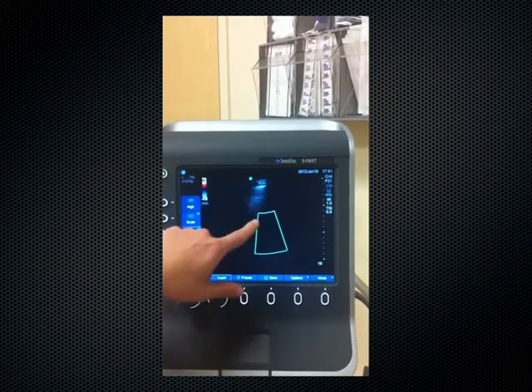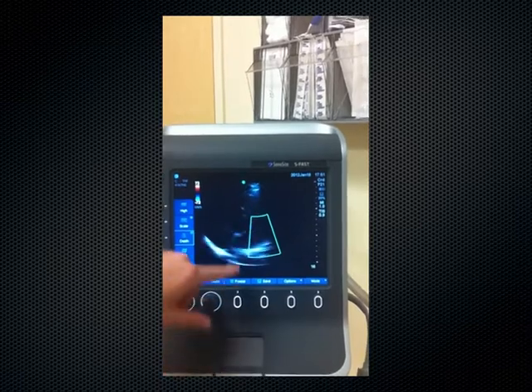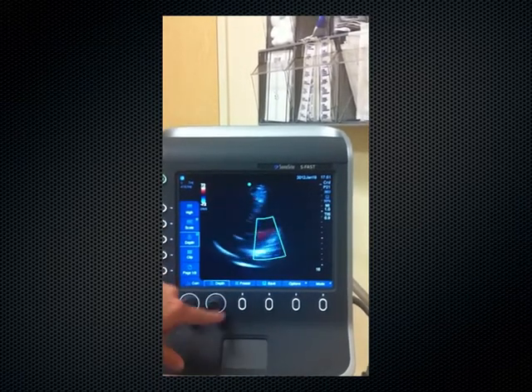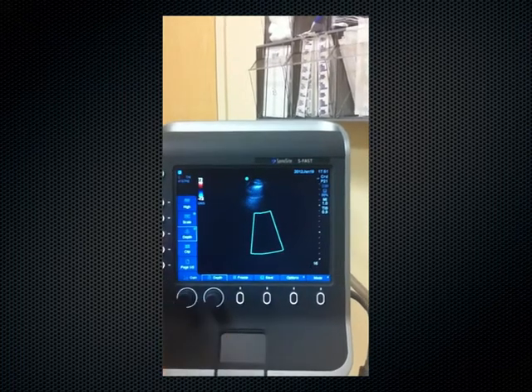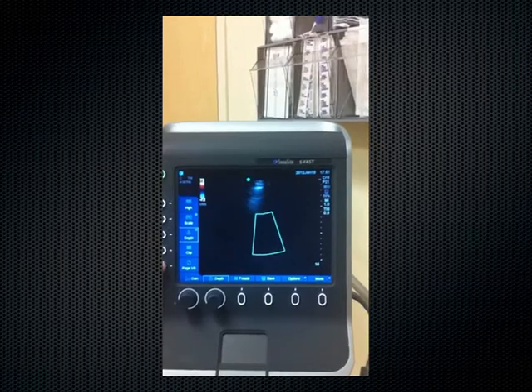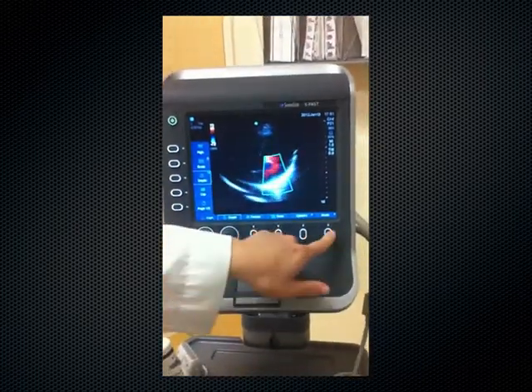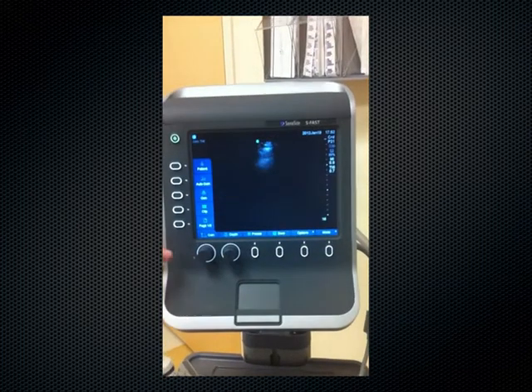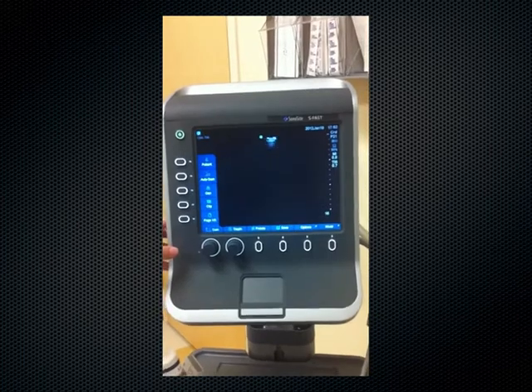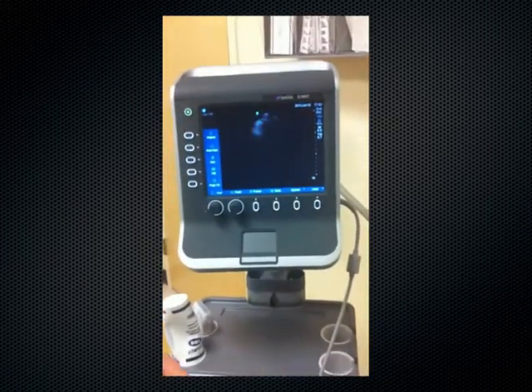What you see also here is the aortic outflow tract, and that's actually a 5-chamber view right here. The next thing I need to do is go back to calculations. So I would go mode 2D. Mode 2D. Can I get that off there? And get a nice 5th chamber. Let's see. It's not as easy as it looks.